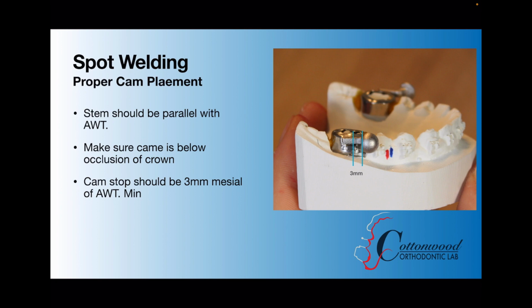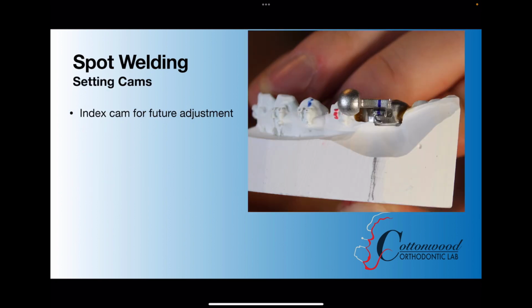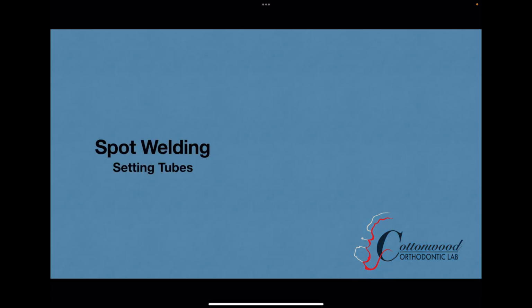This is a real case being put together in real time, so it really indicates how everything can come together when you follow these rules. Next, I like to always mark my cams so that I can adjust that mesial or distal in the future and know where I'm going with that, okay? So now we're going to move on to the upper.